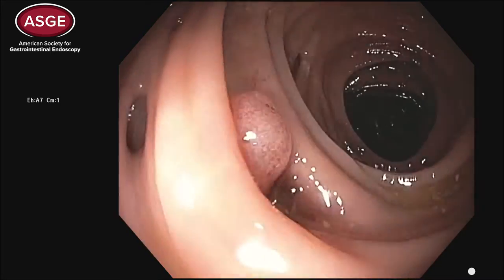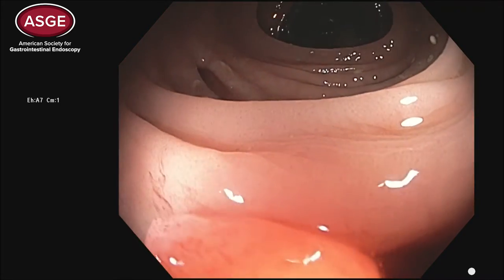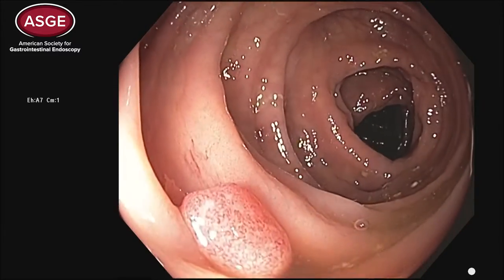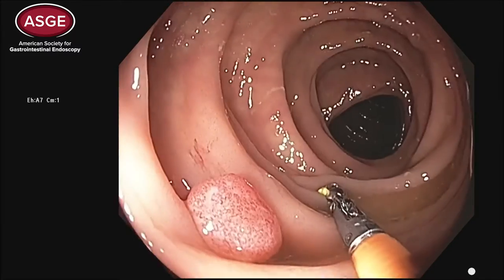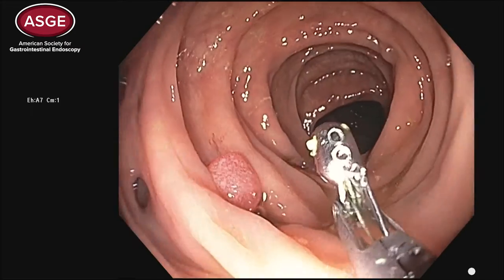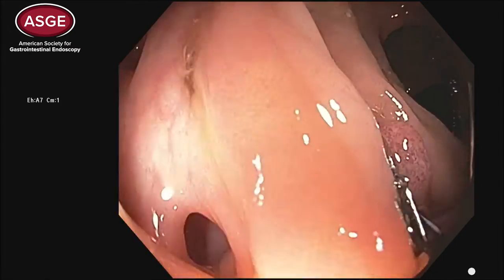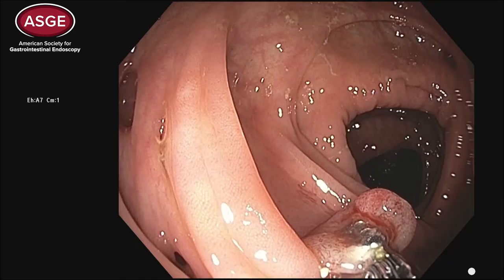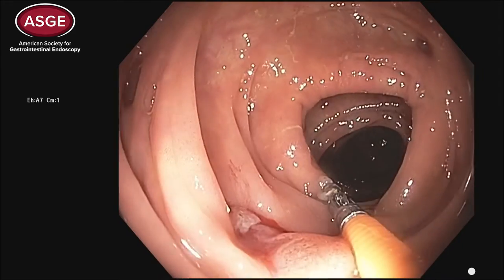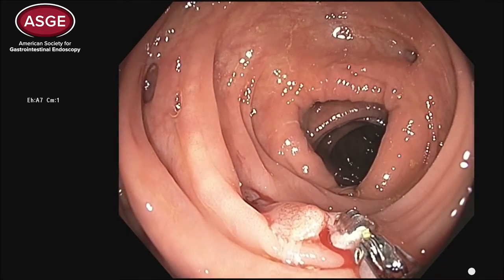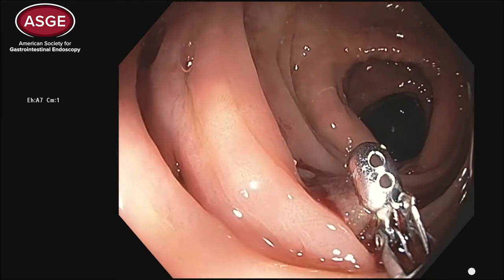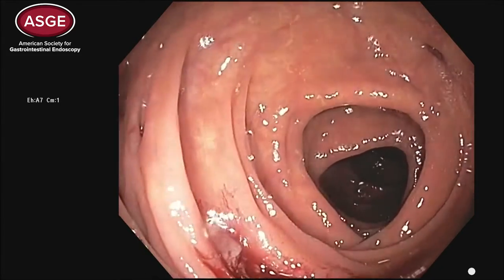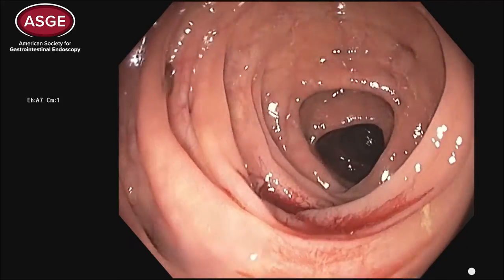These are typically small lesions located right in the diverticulum. Most of them are in the sigmoid, and only occasionally do you see them over a centimeter in size — usually fairly smooth. The clues are the absence of any discernible pit pattern on the surface, and they often appear ulcerated or have some patchy exudate on the surface, sometimes with an irregular vascular pattern.